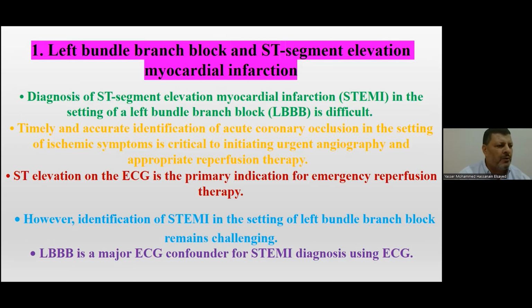ST segment elevation on the ECG is the primary indication for emergency reperfusion therapy. However, identification of STEMI in the setting of left bundle branch block remains challenging. Left bundle branch block is a major ECG finding affecting STEMI diagnosis. Sgarbossa criteria and its modification.